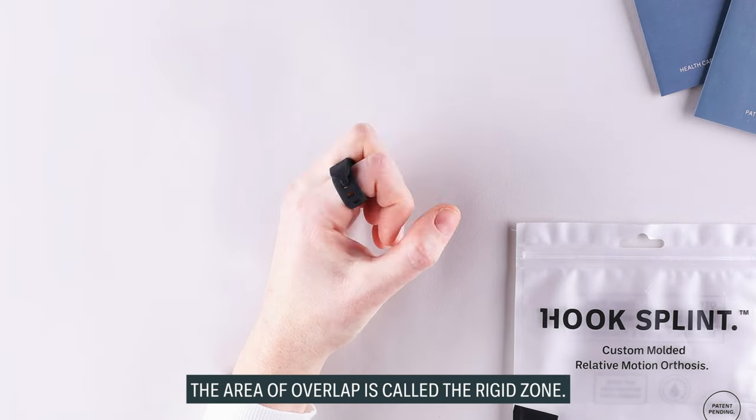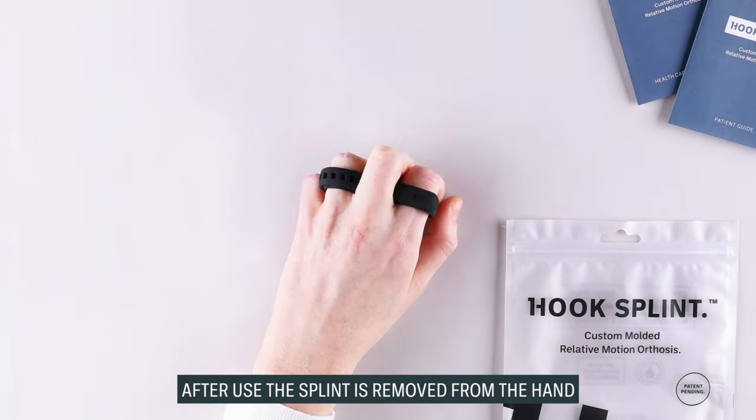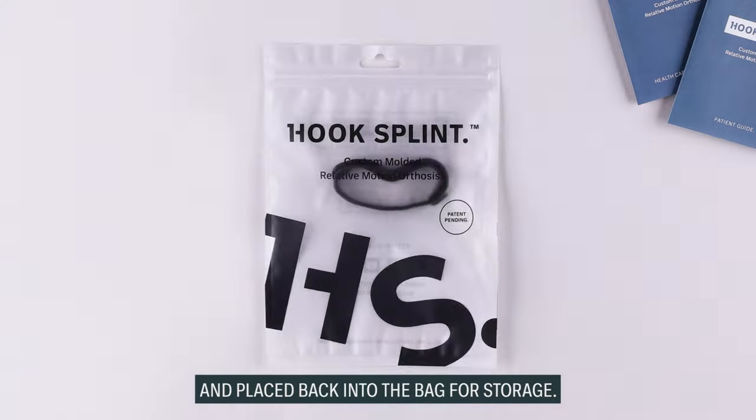The area of overlap is called the rigid zone, and it is there to provide extra stability. After use, the splint is removed from the hand and placed back into the bag for storage.